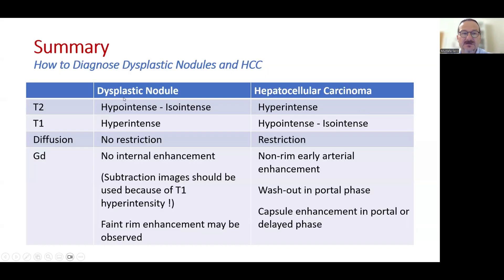In summary, a dysplastic nodule is hypo-intense or iso-intense on T2, hyper-intense on T1 because of the iron content, with no diffusion restriction and no enhancement. Hepatocellular carcinoma is hyper-intense on T2, shows diffusion restriction, and has a typical contrast enhancement pattern: non-rim early arterial enhancement, washout in the portal phase, and capsule enhancement in the portal or delayed phase.